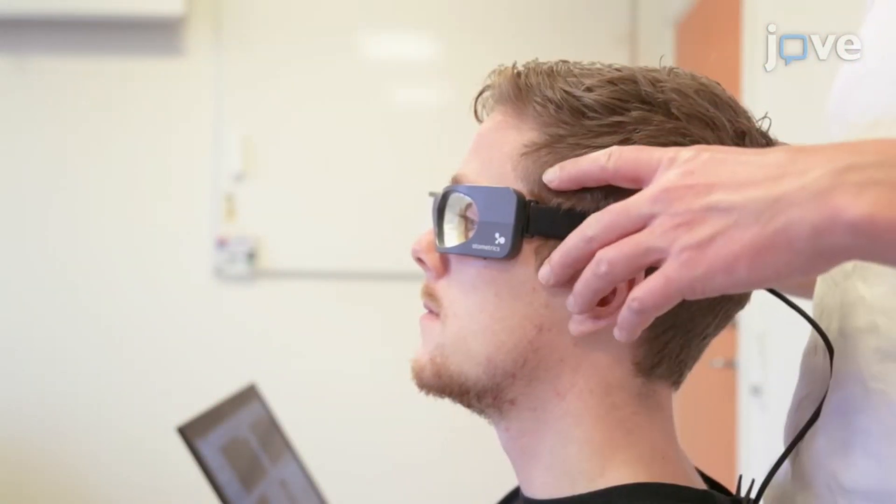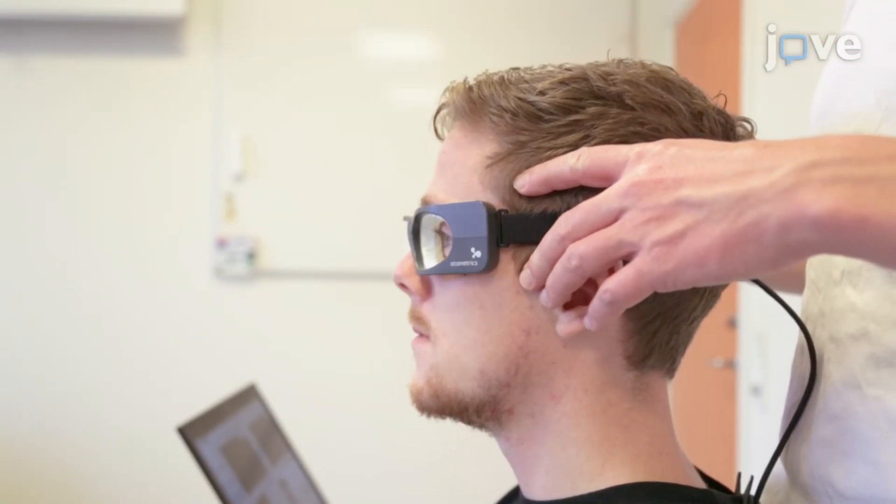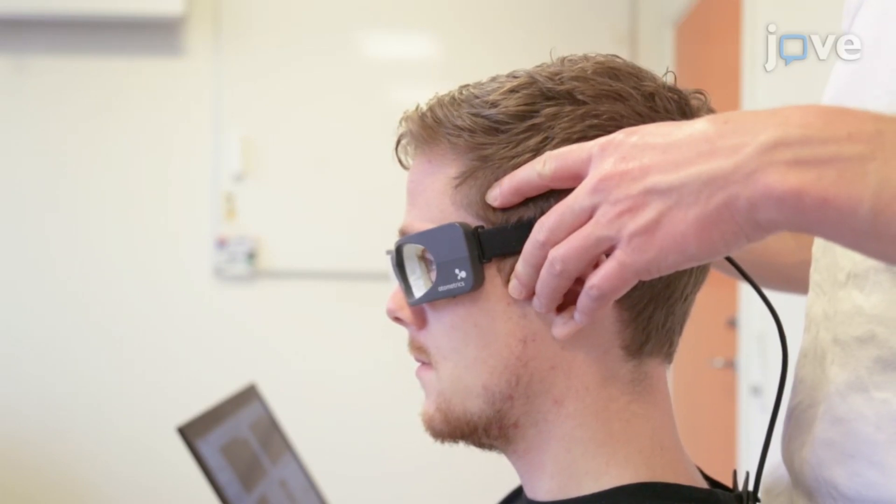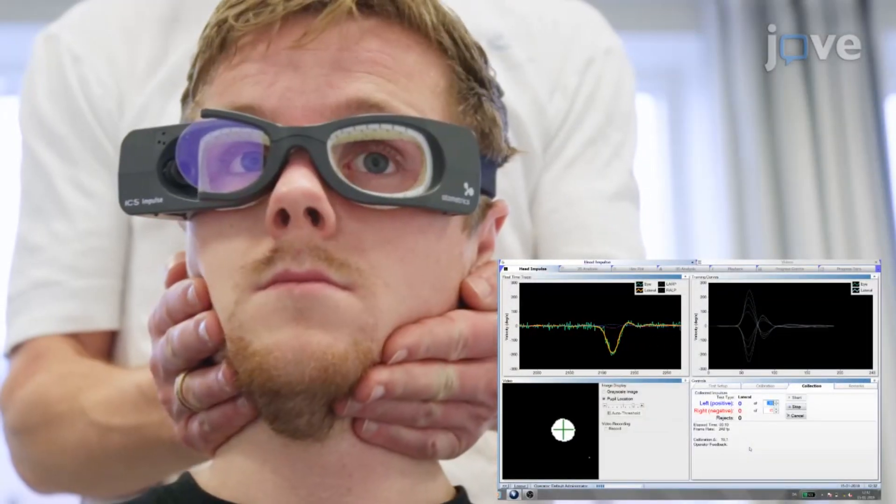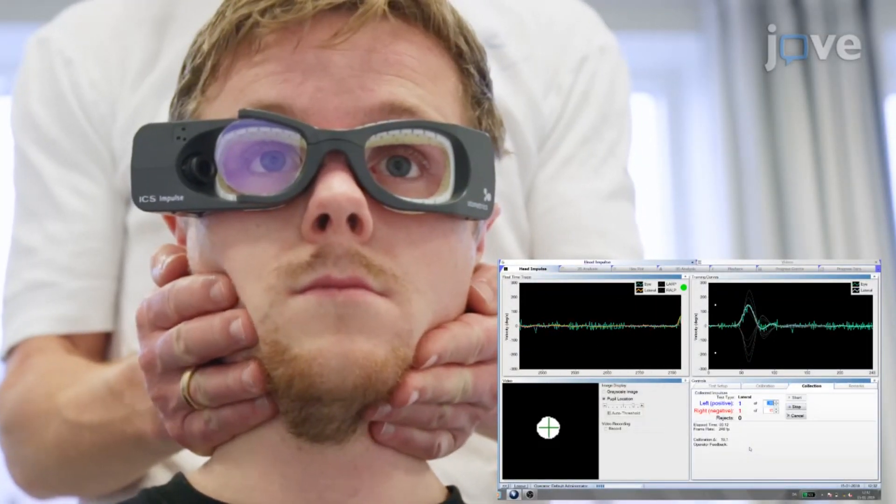Next, turn the participant's head 30 degrees forward in the pitch plane to position the horizontal SCCs completely horizontal, and deliver between 10 and 20 head impulses to each side.